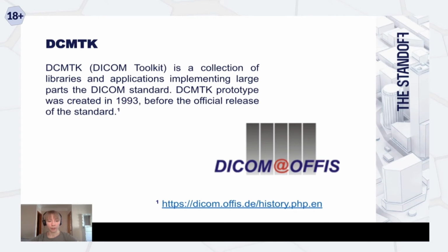And then I think we should go to the next vendor, DCMTK, the DICOM Toolkit, which is a set of tools to convert DICOM files. And this toolkit includes the DICOM server. What's interesting here is that this vendor started development when the development of the protocol itself started. And this implementation of the protocol is a standard for other vendors.